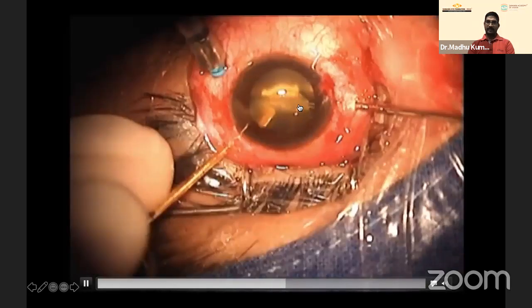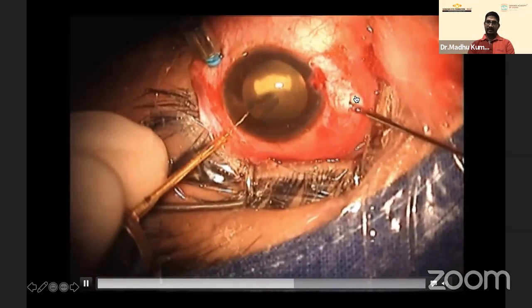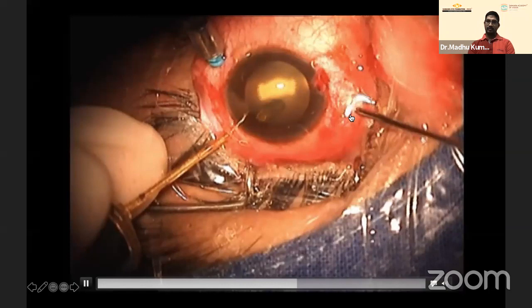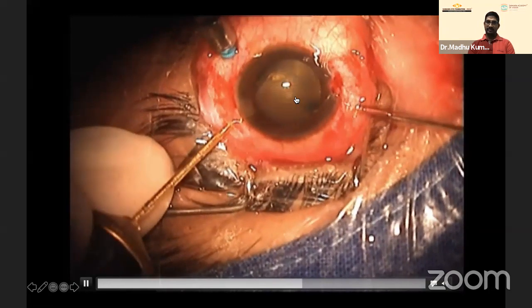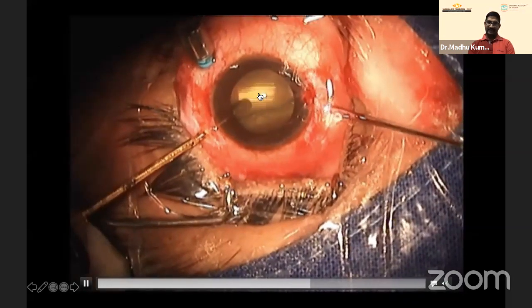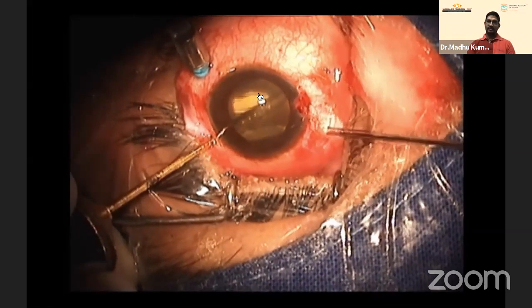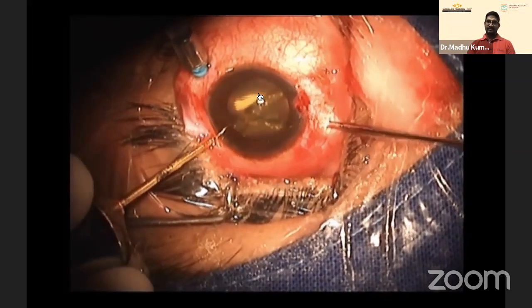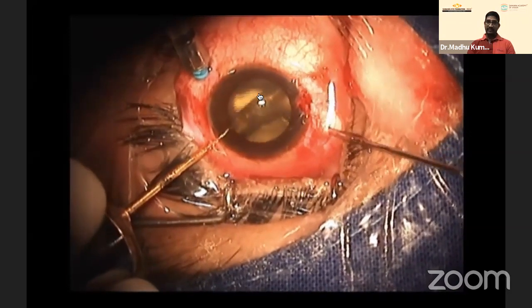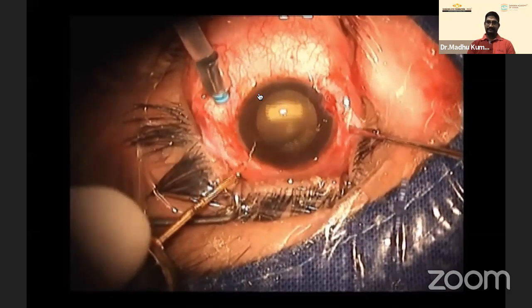The magnet was used in the non-dominant hand and the sclerotomy was enlarged to remove the foreign body — which was quite large. Ideally for such large foreign bodies the lens is sacrificed and the foreign body removed through a clear corneal or limbal approach. However, because the foreign body was less than 6 mm and the patient was a driver (RTC driver), lens preservation was attempted.